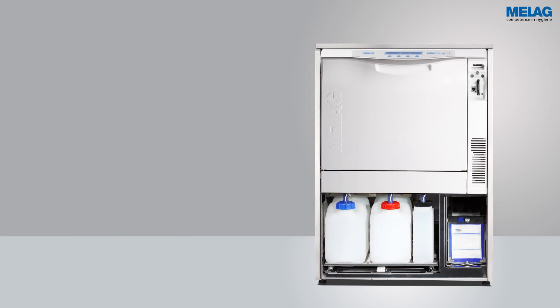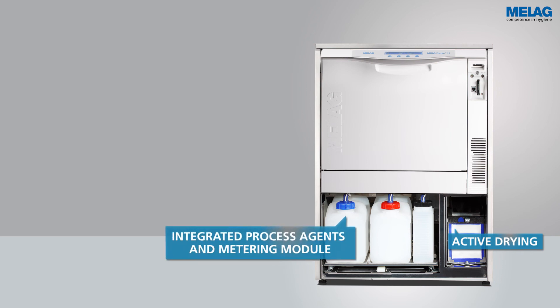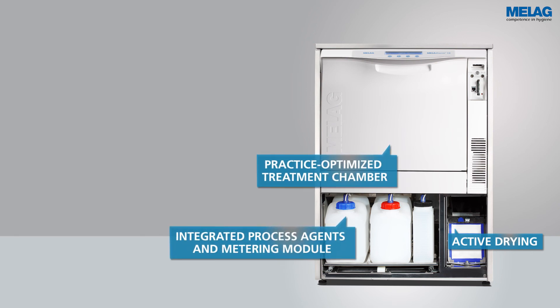Melatherm 10 offers active drying, an integrated process agents and metering module, a practice-optimised treatment chamber, as well as integrated documentation without any additional effort.